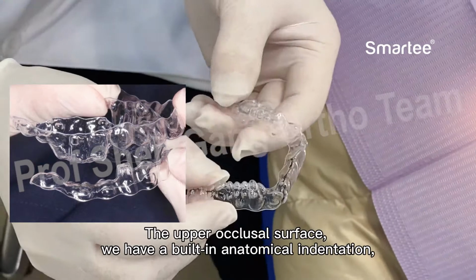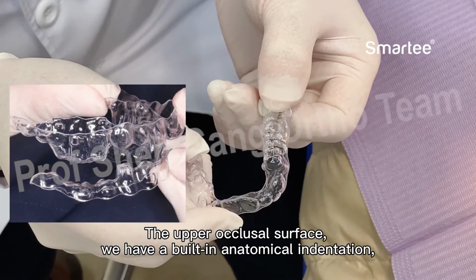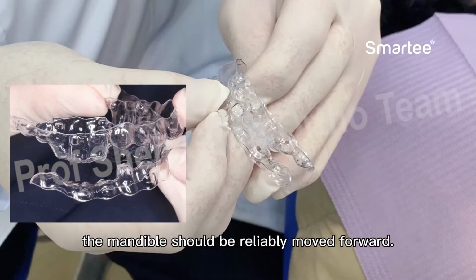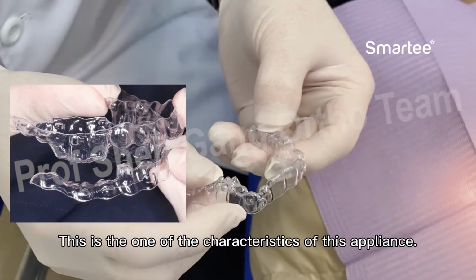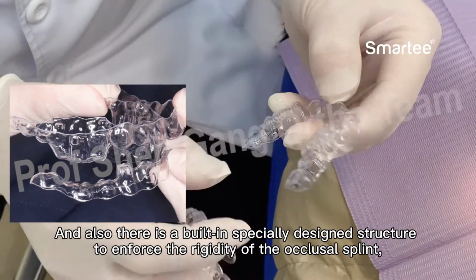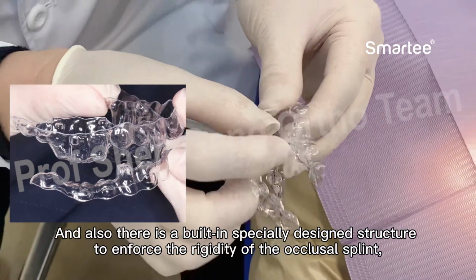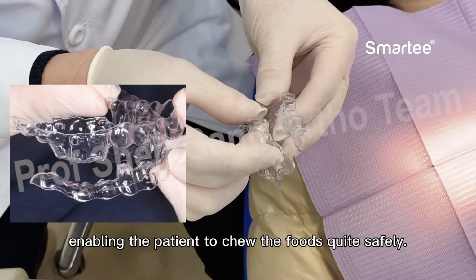On the upper occlusal surface, we have a built-in anatomical indentation. So when the opposing dentition matches the upper one, the mandible is reliably moved forward. This is one of the characteristics of this appliance. Also, we have a specially designed built-in structure to enforce the rigidity of the occlusal splint, enabling the patient to chew food quite safely.